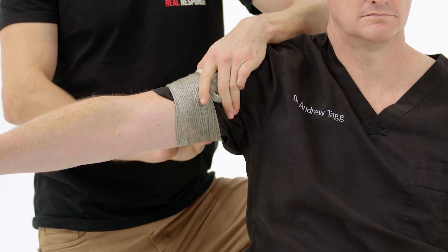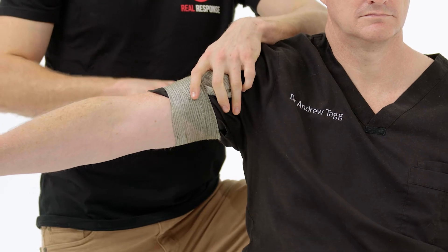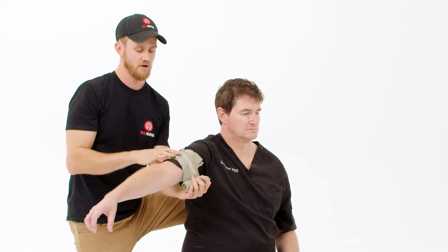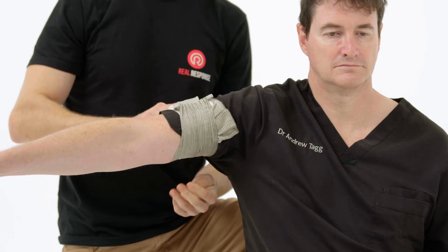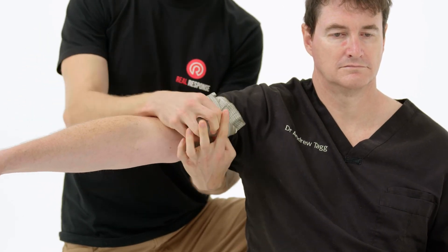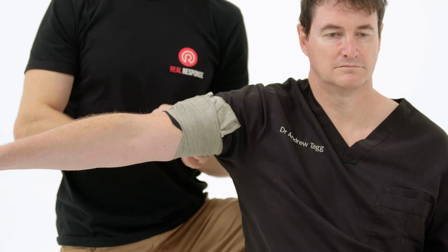From here, feed the bandage through the pressure applicator and then back around the opposite way, ensuring that it applies a moderate amount of pressure to the wound. Continue wrapping the bandage around the arm, applying enough pressure to control the hemorrhage but not too much.